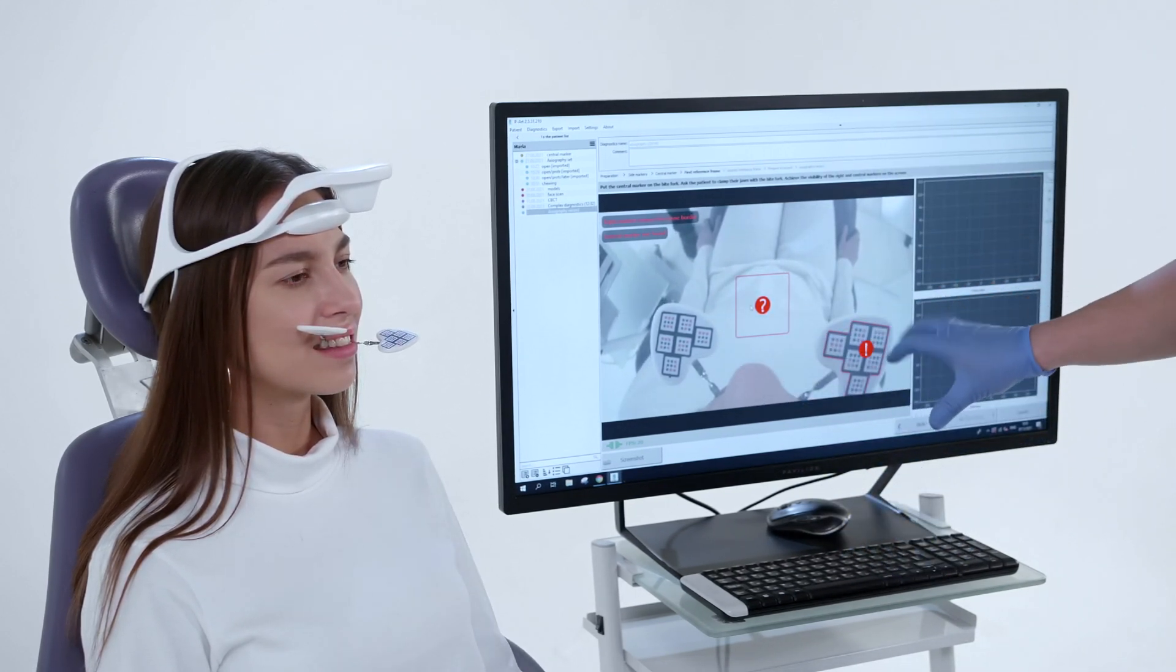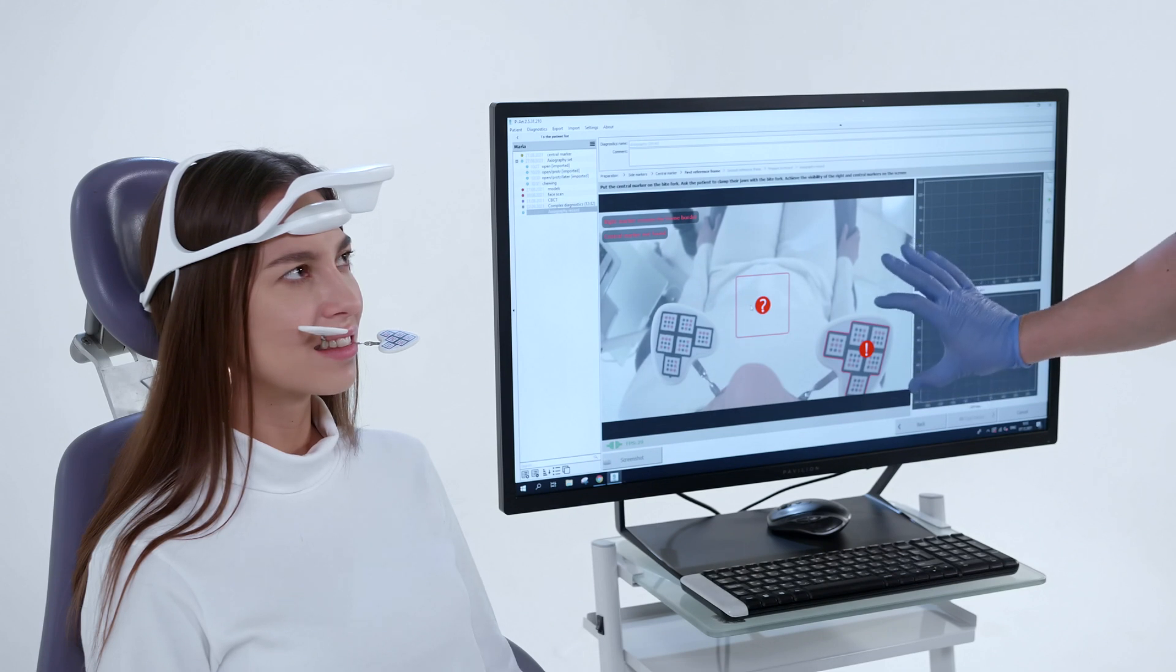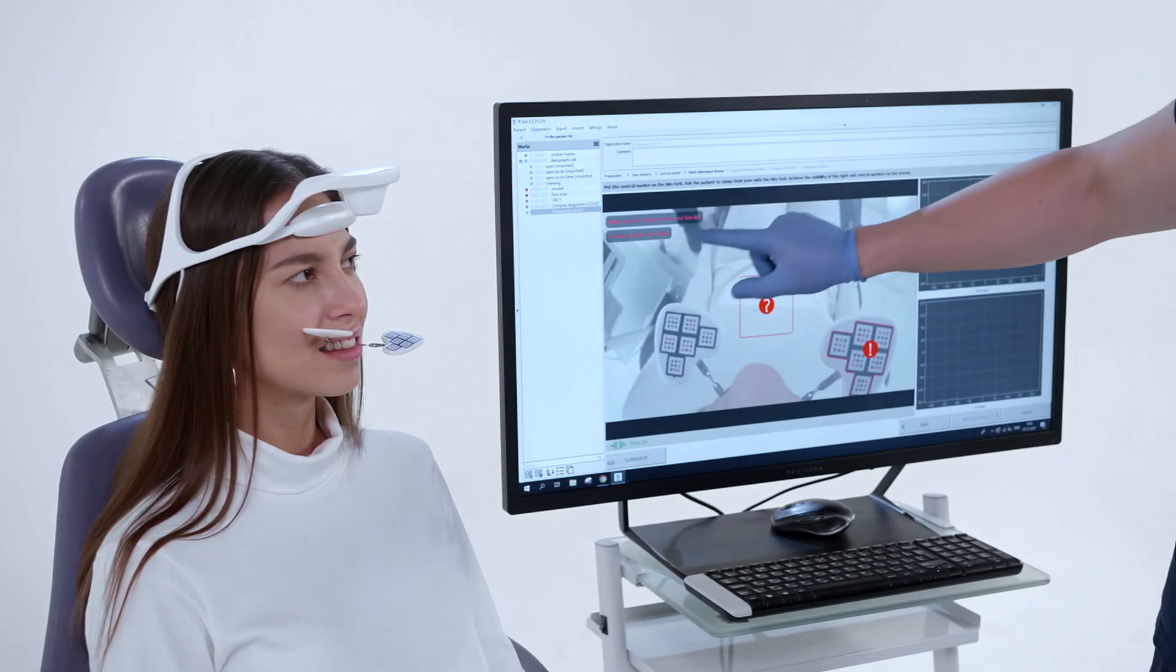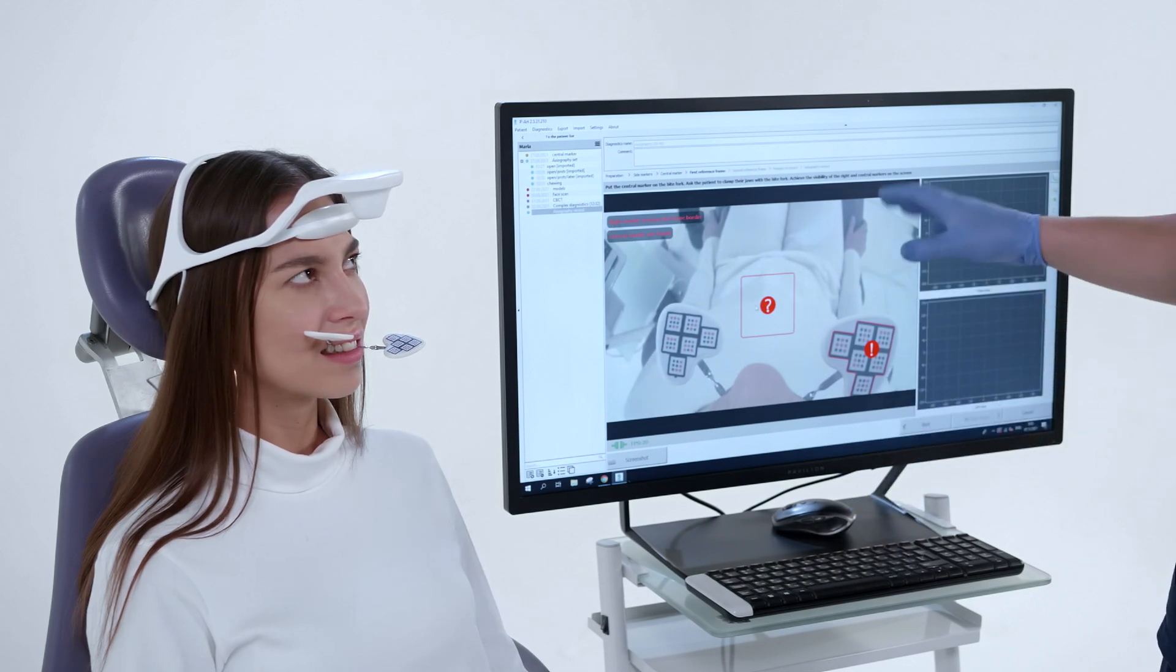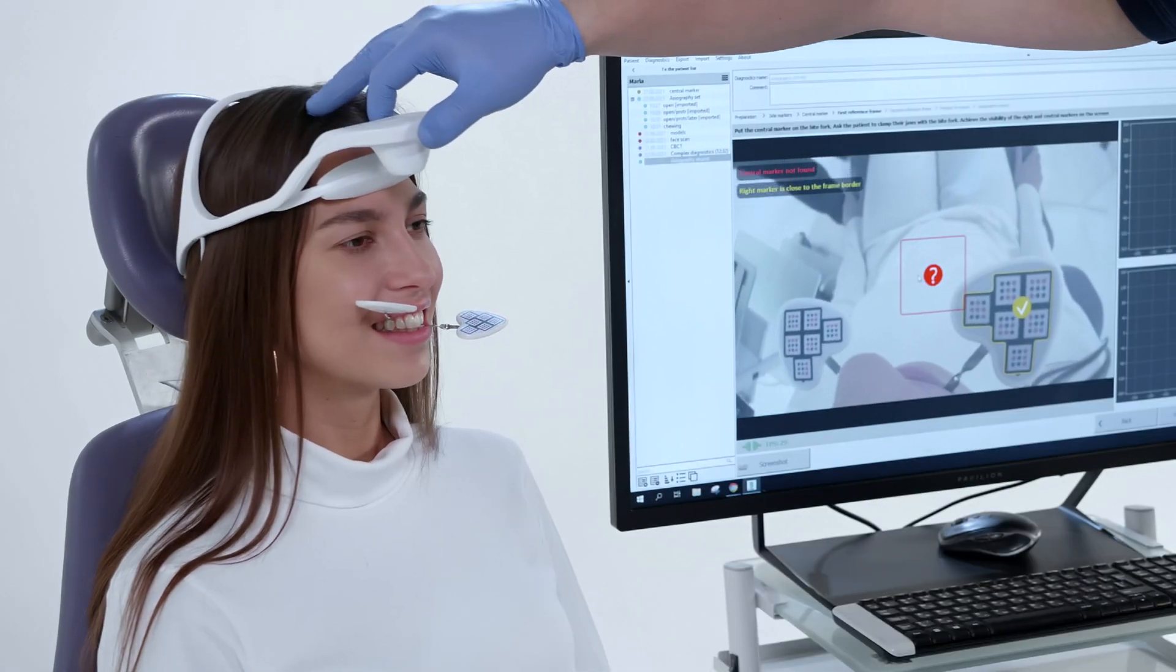The markers must be in the green zone. Yellow zone is acceptable. If the markers are located in the red zone, then the location of the Axiograph on the head must be corrected.